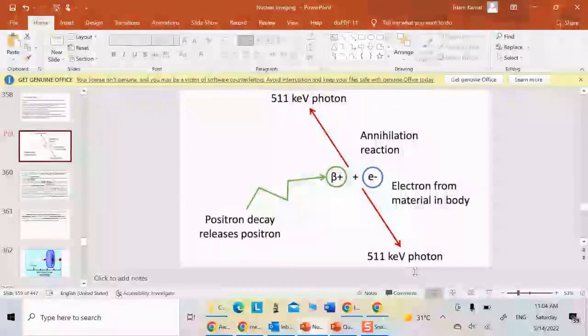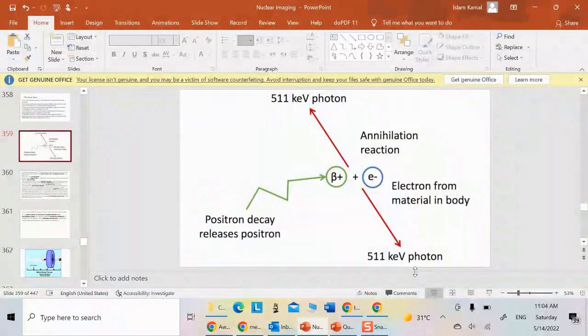This sodium iodide crystal has a stopping power and attenuation that cannot stop the 511 kilo electron volts, but it can work on 140 kilo electron volts and can work on 364 kilo electron volts, which are the lower energy levels of gamma photons. So for the 511 keV photon, I need a crystal with different properties to be able to stop the high energy gamma photon coming in at 511.